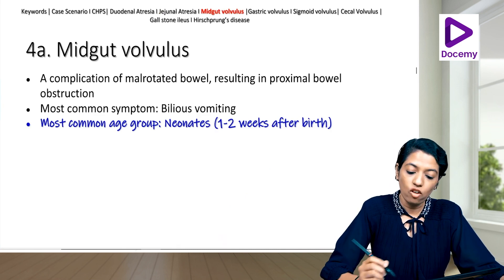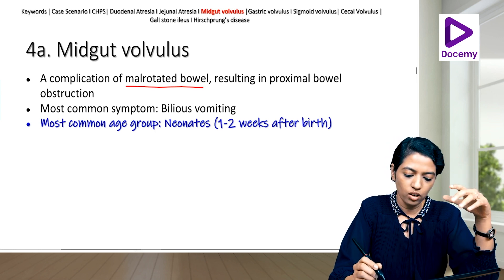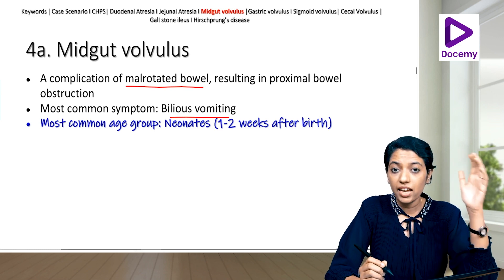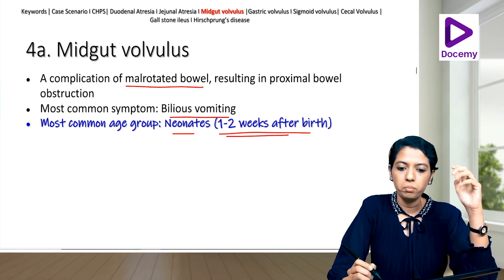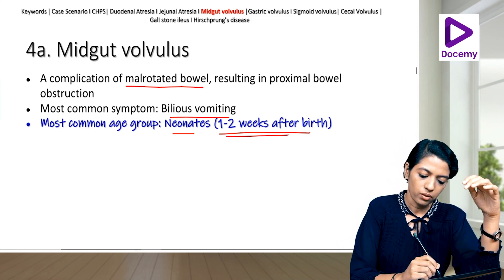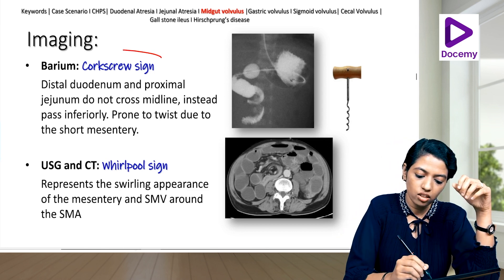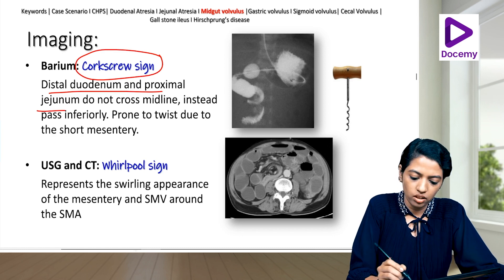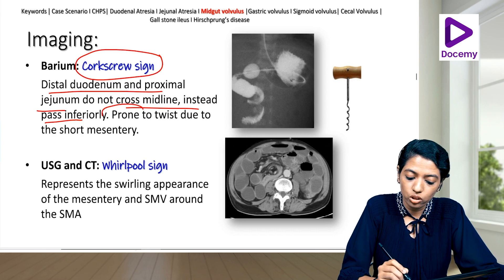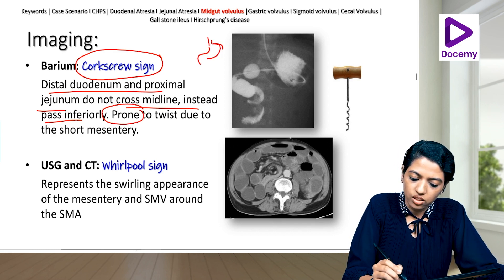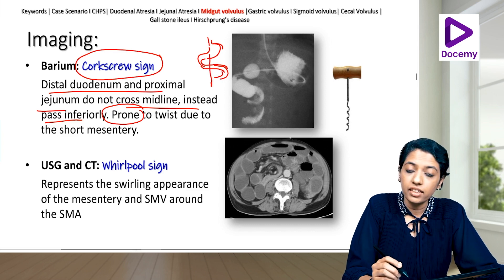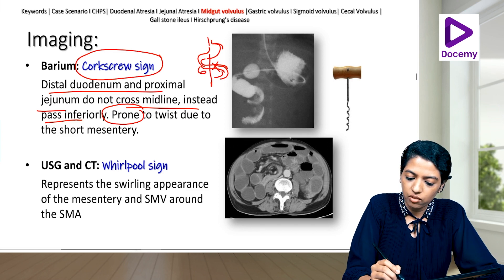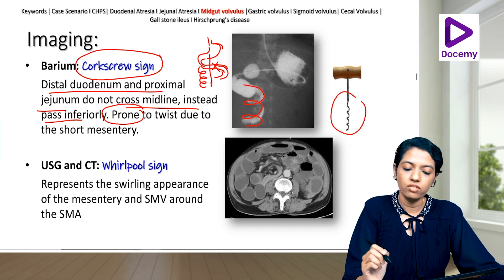Midgut volvulus is a complication of malrotated bowel resulting in proximal bowel obstruction, most commonly in neonates one to two weeks after birth. On barium, the classic corkscrew sign is seen — the distal duodenum and proximal jejunum do not cross the midline as normal but pass inferiorly, forming the corkscrew pattern.